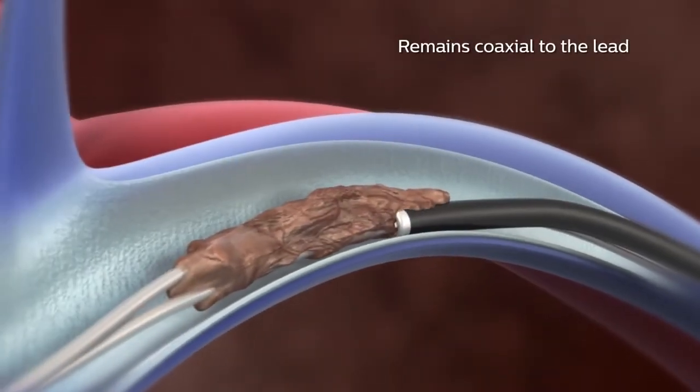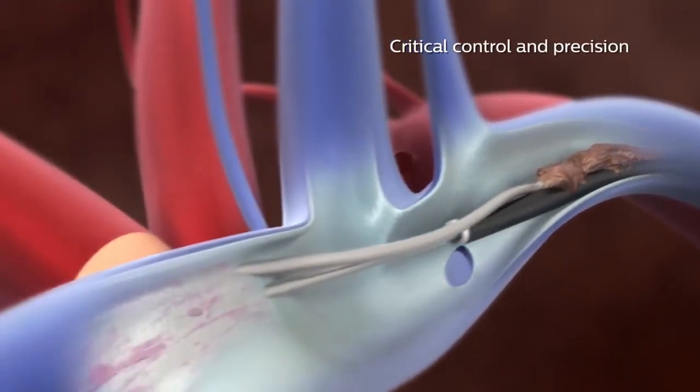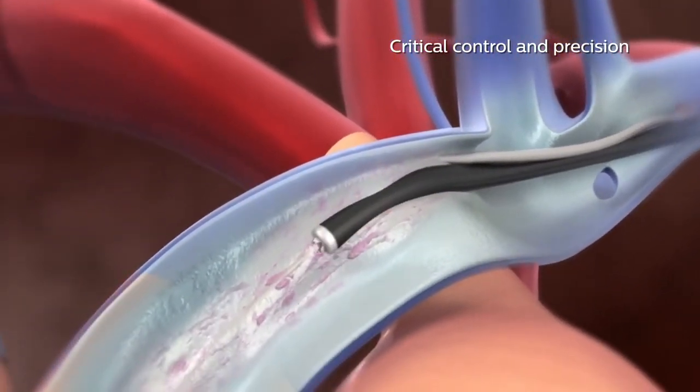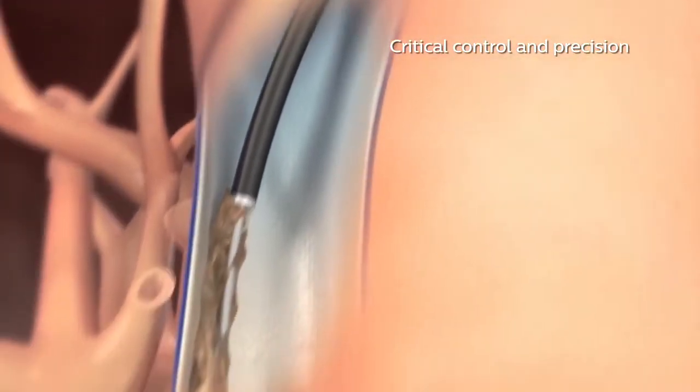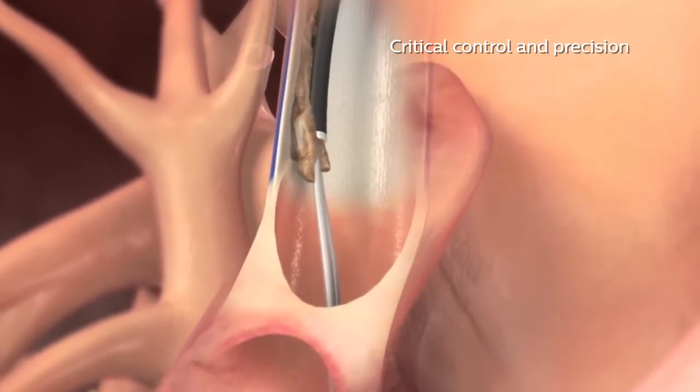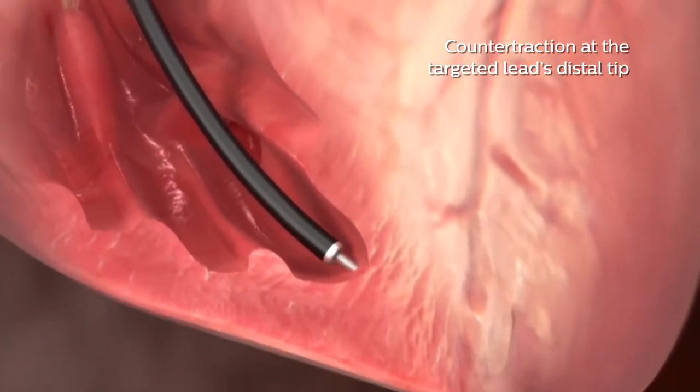Tightrail's flexibility helps the device remain coaxial to the lead. With its flexibility, shielded blade, and static shaft, Tightrail provides the critical control and precision you're looking for in lead extraction procedures. The shielded cutting tip design provides counter traction at the targeted lead's distal tip.